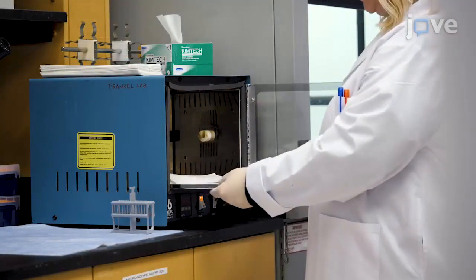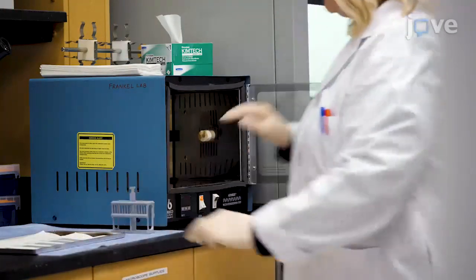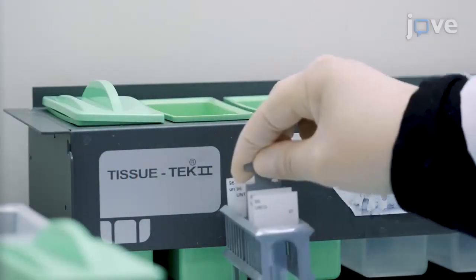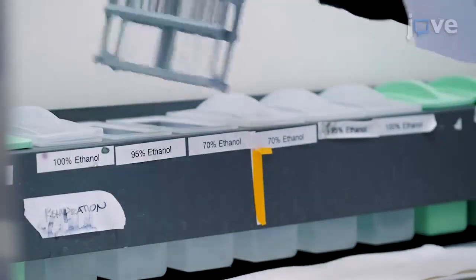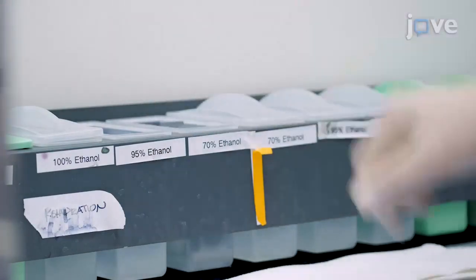Take the slides out of the oven and allow them to cool for 5 to 10 minutes in a vertical slide rack. Then use a slide staining set to treat the slides three times with xylene and once with 100% ethanol, 95% ethanol, and 70% ethanol for 10 minutes each.